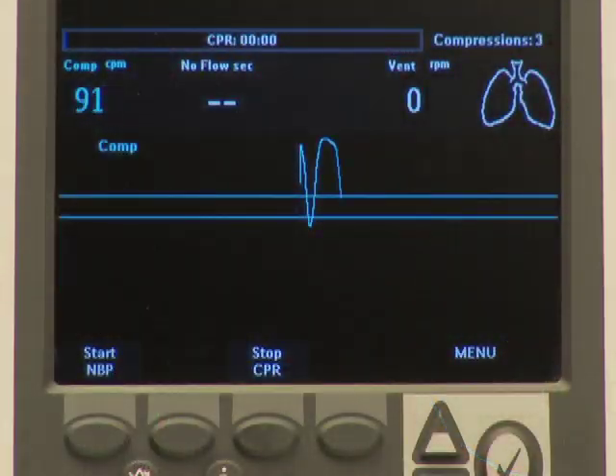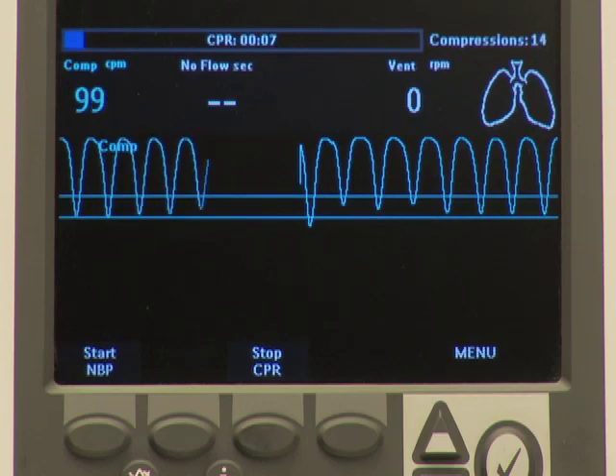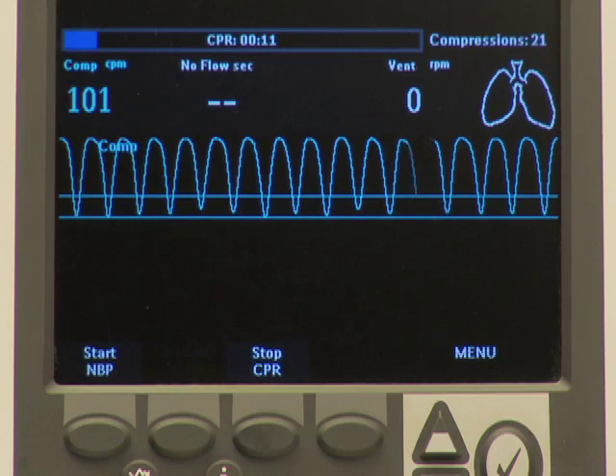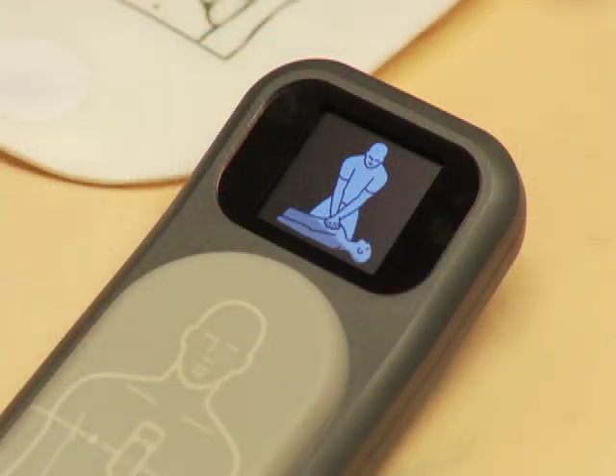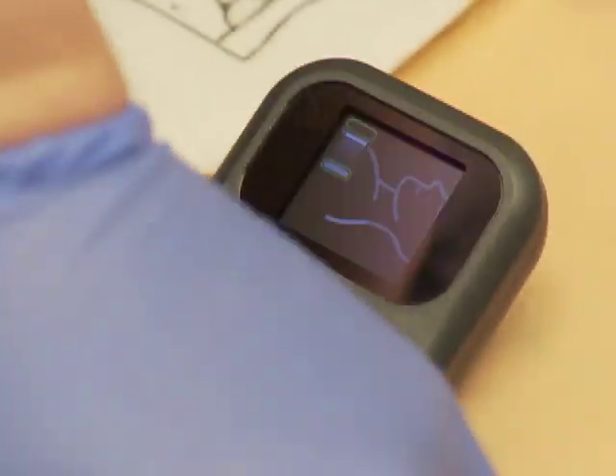It is not necessary to press the Start CPR soft key. When CPR compressions start, QCPR detects the activity and engages automatically. First, the CPR meter display shows a patient outline as a prompt to start compressions. When the CPR meter first detects compressions, its display changes to the enlarged compression indicators.